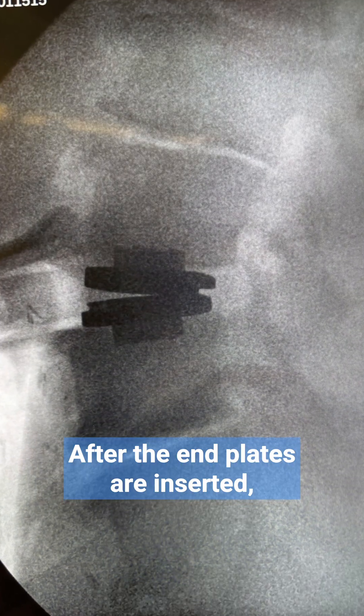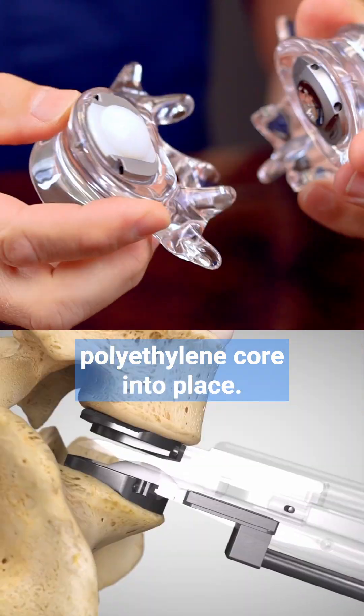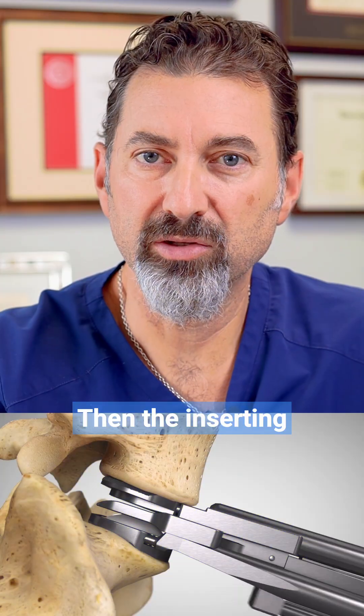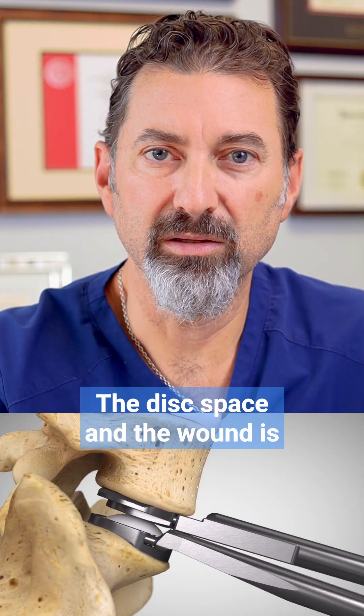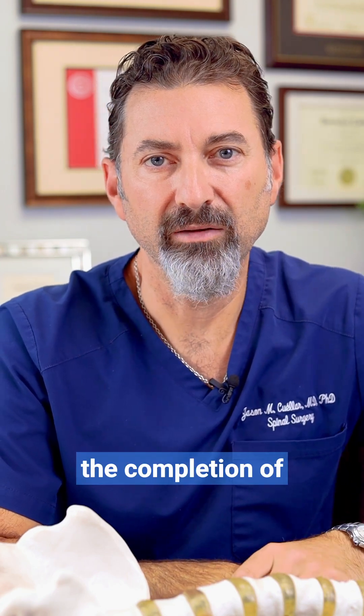After the end plates are inserted, I insert the polyethylene core into place, and this is snapped into the lower end plate of the metal. Then the inserting devices are removed, the disc space and wound is irrigated and closed up, and that's the completion of the operation.